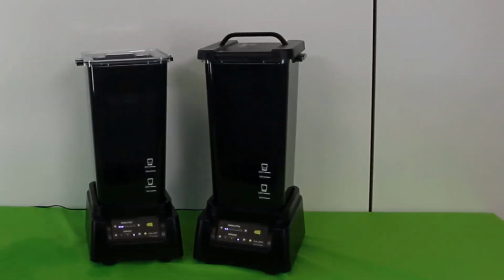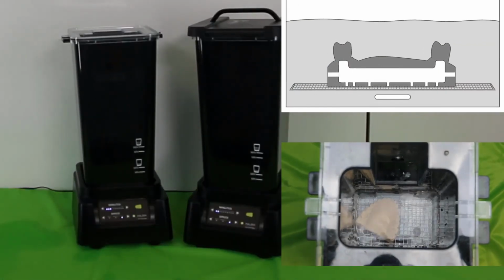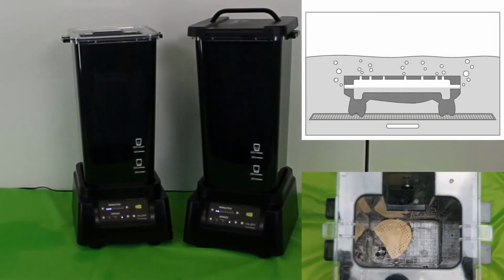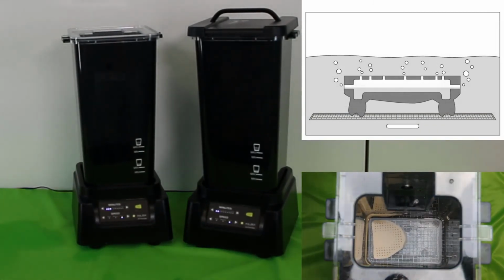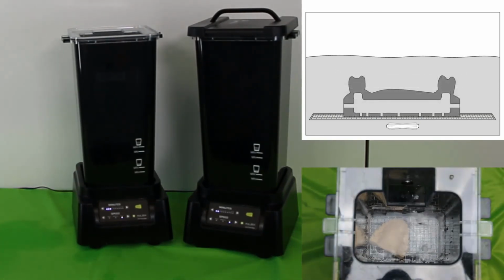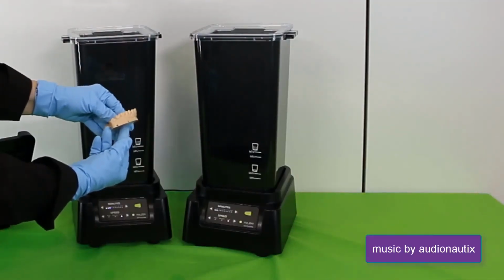Place the model with the base down. While the isopropanol is pumped into the inner container and the model is already covered, the model is rotated to let the air escape. After the air has escaped, the model is left lying on the grid with the base down for the cleaning time. Continue with the final curing in the recommended polymerization unit as usual.